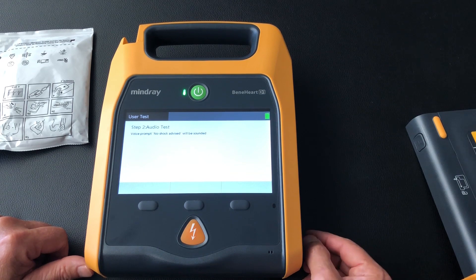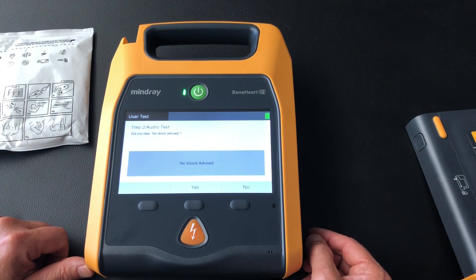Now it's going to go through an audio test. Did we hear that? Yes.